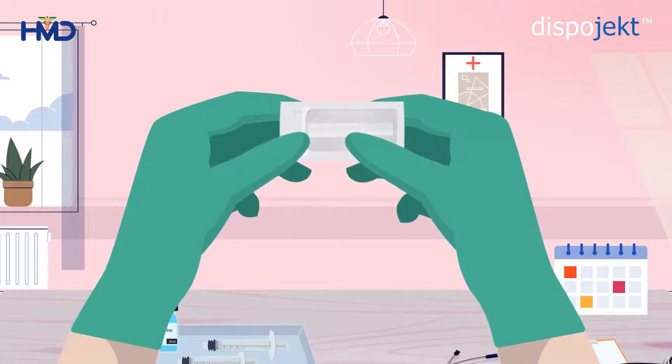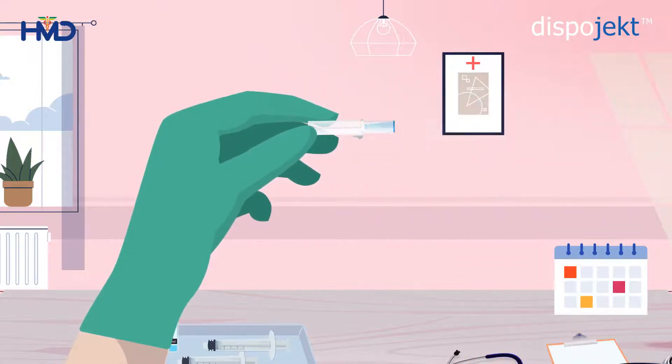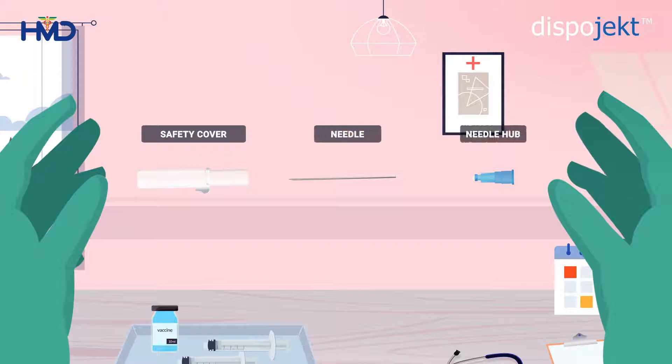Firstly, you need to extract the needle from its package. Peel open the blister pack and take out the Dispoject SIP Shield Safety Needle. The Dispoject SIP Shield Safety Needle consists of three parts: the safety cover, the needle, and the needle hub. The safety outer cap prevents accidental injuries and cross-contamination.